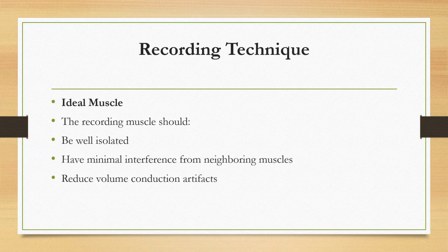Recording technique. The ideal muscle for the study: the recording muscle should be well isolated, should have minimal interference from the neighboring muscles, and should have reduced volume conduction artifacts.